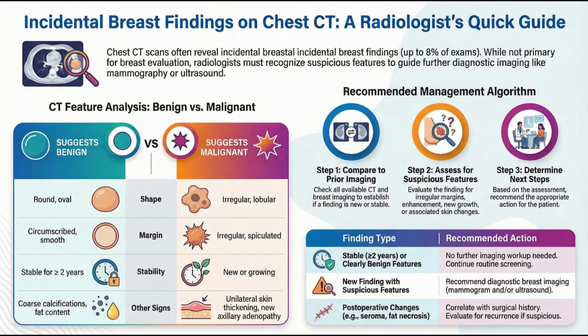Enlarged lymph nodes. Lymphadenopathy. So how does an expert tell the difference between a normal bit of muscle and a potentially dangerous finding? This is the real teaching point from the sources. You have to use the coronal views. The front-on view. Right. Because on that axial slice, the muscle might look round. But on the coronal view, you see its true shape. It's long and linear, like a muscle should be. And that immediately tells you it's not a round, suspicious mass or lymph node. Instantly. It's a simple trick that avoids a lot of unnecessary workup.